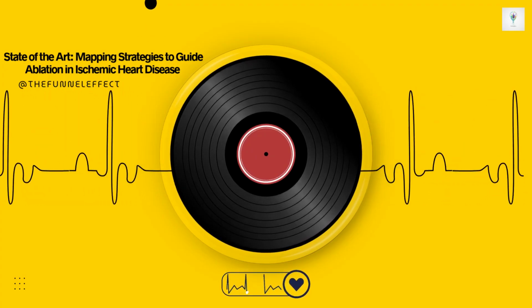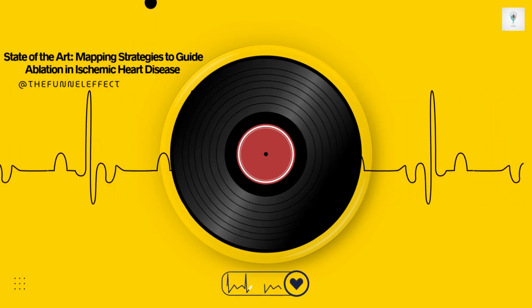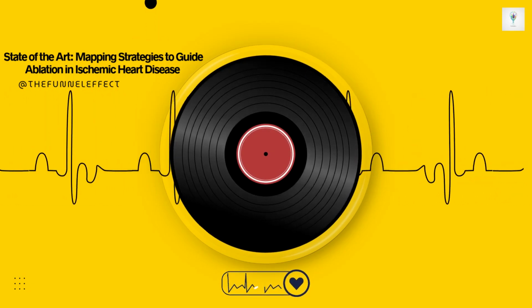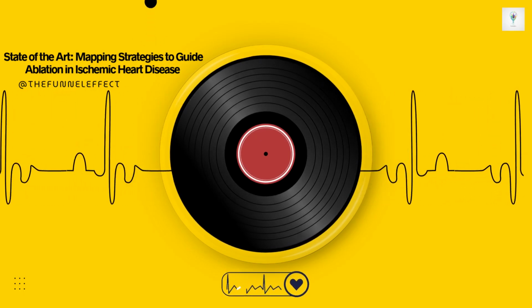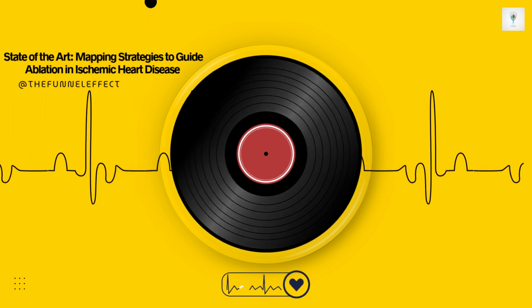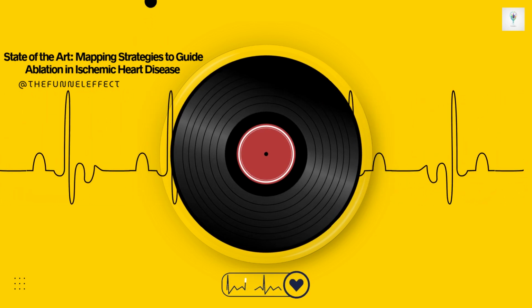It improves outcomes, especially in patients who might have smaller, more scattered areas of scar. Derival's group showed that if they targeted EDPs as the very first step in the procedure, they could eliminate all inducible VT in about two thirds of their patients. That really highlights functional mapping not just as an add-on, but potentially as a primary, highly effective strategy.